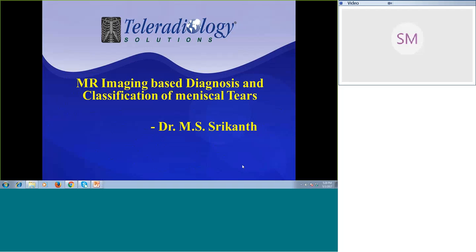Hi, good evening, everyone. Today's topic is MR imaging based diagnosis and classification of the meniscal tears.